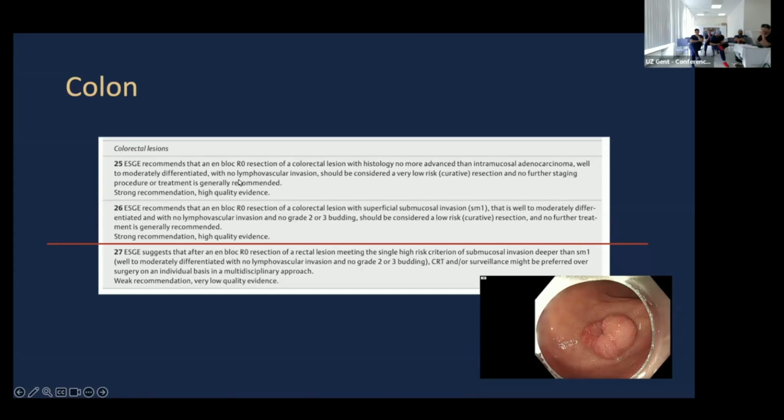Okay. It doesn't actually go into when you should or should not do this, this document anyway. EMR, this is covered in the polypectomy guideline. We'll go to that in a minute. This is more, you've done ESD, what do you do?